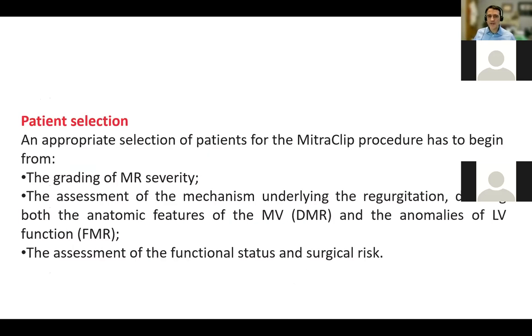Well, patient selection obviously is important, and assessing that patient on a global basis is really important. So good echo is critical to grading obviously the severity of the mitral insufficiency and trying to understand the mechanism for that. So transesophageal echo is important, as well as a few things that we look for that are absolutely critical when we do transesophageal echo. And there are a few published outlines out there of the kinds of things we look at on a TE.